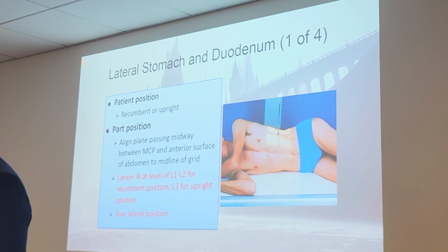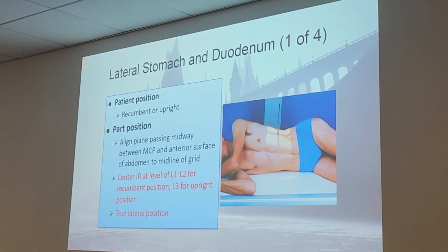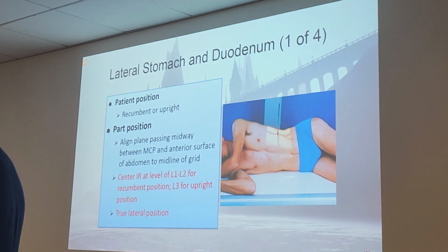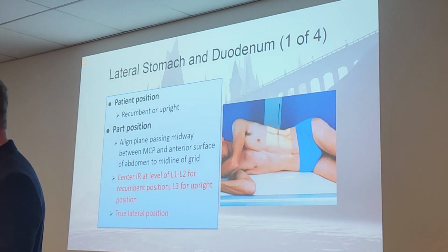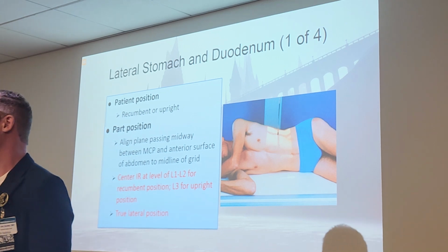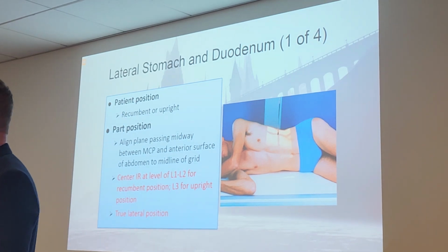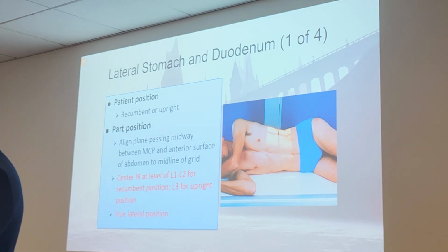Let's look at the lateral stomach and duodenum. It can also be done recumbent or upright. Where's the centering for this one? L1, L2 for recumbent, L3 for upright. True lateral position. This one's going to share the same centering as the RPO and the PA. The LPO is a little bit different, remember, because the LPO is in between the xiphoid and the lower rib margin. And when you're upright, centering always goes lower, just a little bit because of gravity pulling everything down.